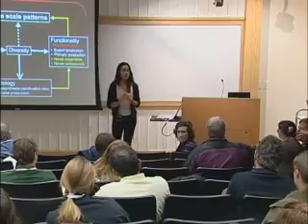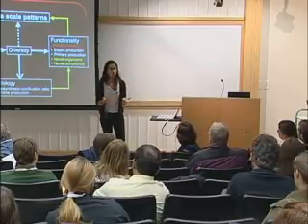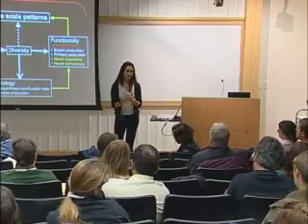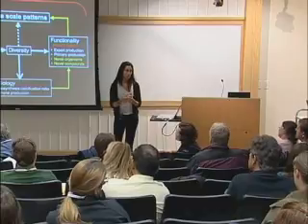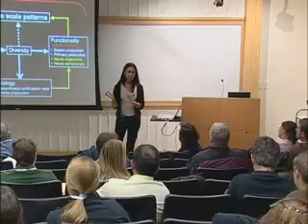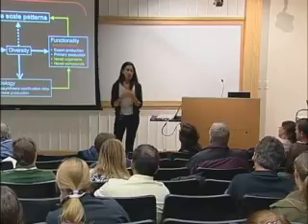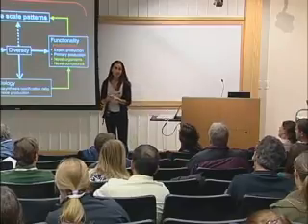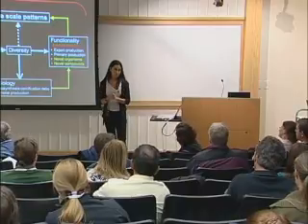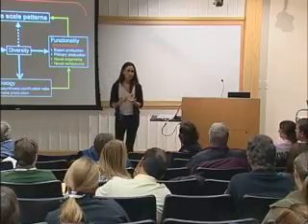Well, when we get them from the culture collection, it depends on the culture collection. Some use organic media, some use inorganic media. Most of them use really high inorganic nutrient concentration. So, as I said before, the F/2, which is typically used by many scientists and in some culture collections, uses 880 micromolar nitrate, which is really high. I mean, we use almost 900 micromolar nitrate. So that's crazy, it's really, really high. And we still use very high nutrient levels.